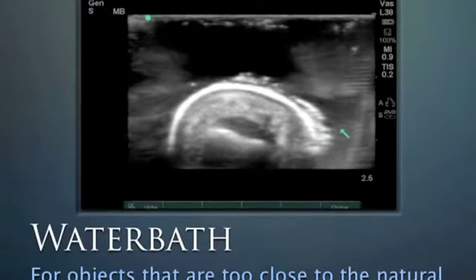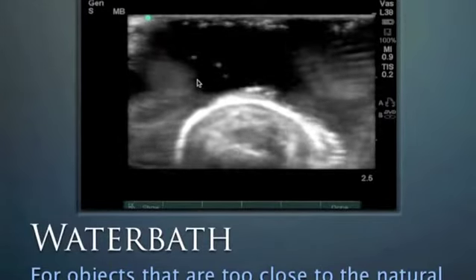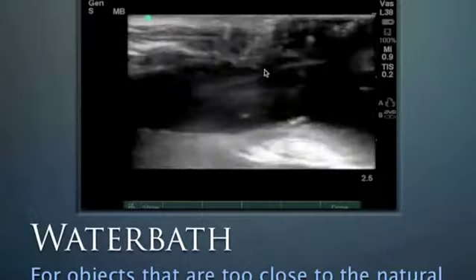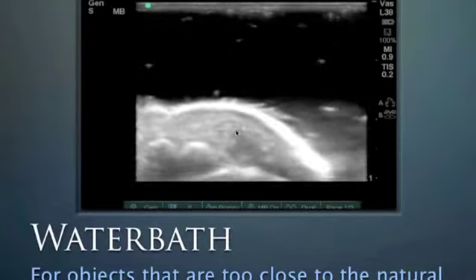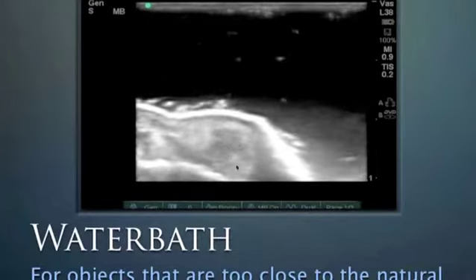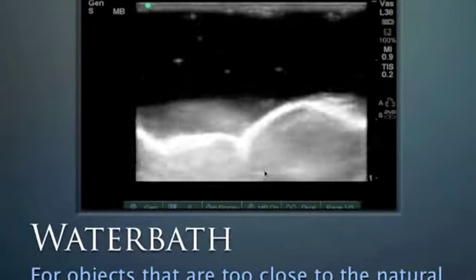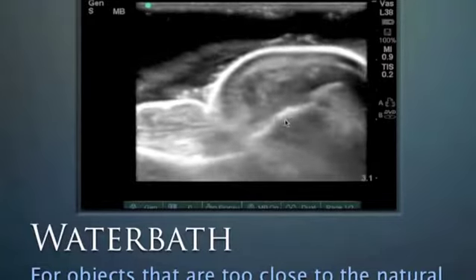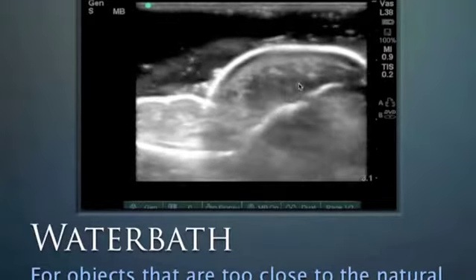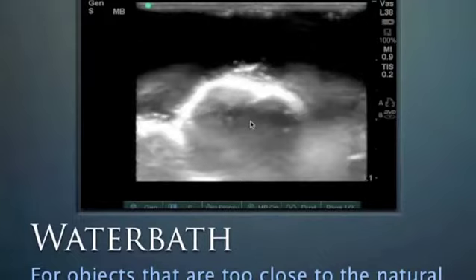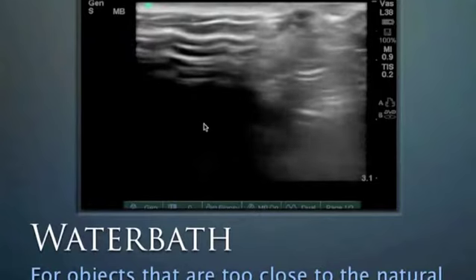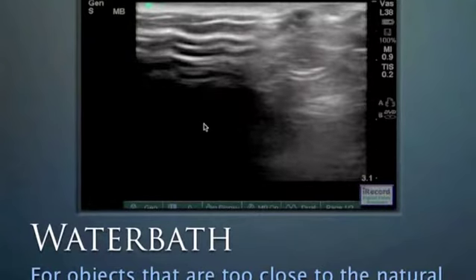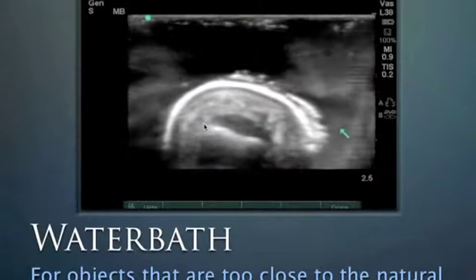Here's another example of a finger in the water bath. Standing away from the finger, we can see this patient has an abscess in the distal tip — the patient is even moving their finger and we can see it clearly. This happens to be the thumb, and we can see hypoechoic debris within the pulpy area. It's much easier to see when using the water bath.